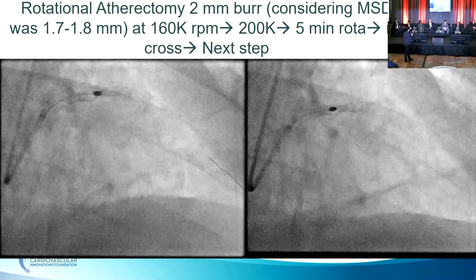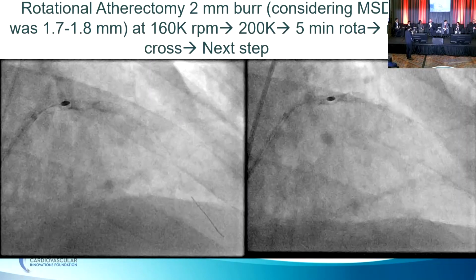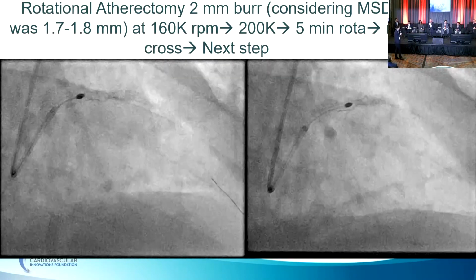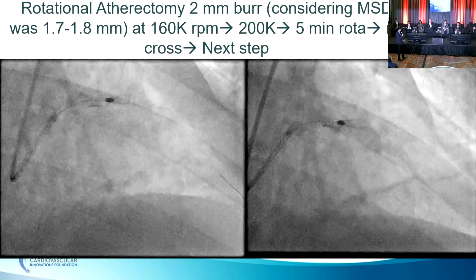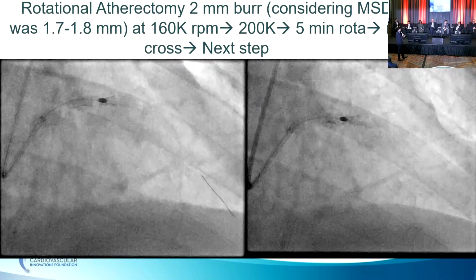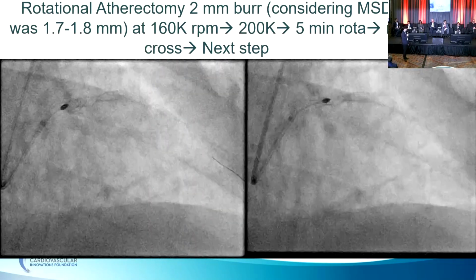Did you consider doing nothing? I'm just throwing it out there, right? Your left main was your culprit. Yes. They've been fine for a year with this. Did it cross your mind to maybe just leave it? Yeah, no, actually no. The patient did not have an event. You're absolutely right. It has been there for 2 years as an under-expanded stent. But we felt that we had to do something. But you're absolutely right. That was another option, to not do anything and leave it alone.